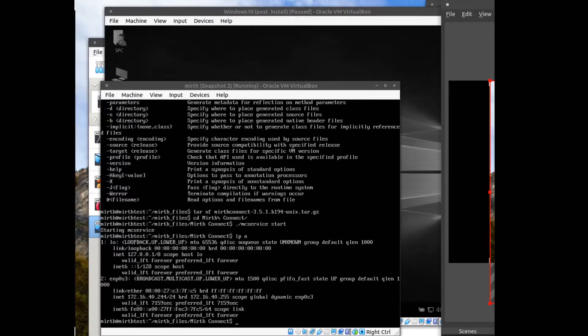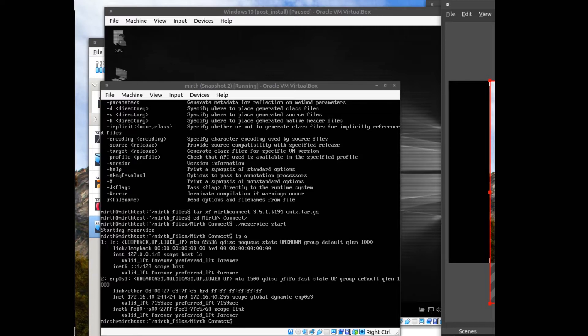Okay, so now that we have Mirth Connect running and we have our IP address for this machine, we can now do the setup for Mirth itself.